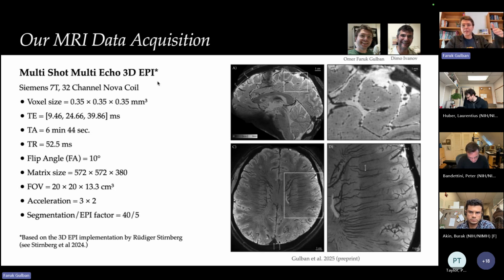If it takes a couple of minutes to acquire the data but 5 to 6 minutes to reconstruct it, and you stack a couple of them in the scanner to have multiple anatomical images to increase your SNR later by averaging, it just crashes the scanner. So we had this funny constraint to play along with: data acquired in around 7 minutes and reconstruction taking 6 minutes, so that we can stack a couple of these imaging runs one next to another without crashing the scanner.